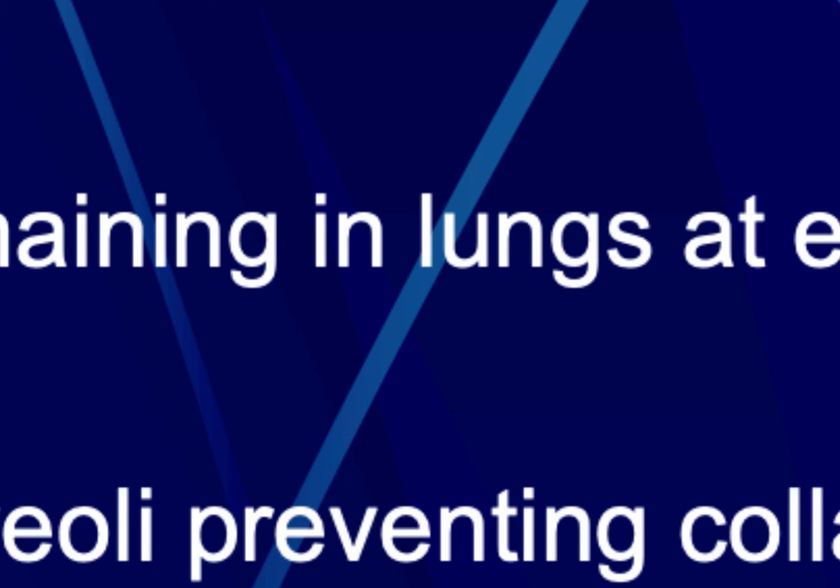All right. It does distend the alveoli, preventing collapse on expiration with that continued positive pressure, specifically when you guys are setting those PEEP levels to whatever you feel your patient needs, right? And it creates a greater surface area for gas exchange. Like I said, those alveoli are already stent open. They're already fully inflated, so that the next time we take that breath, the alveoli is already open. It stents open even more, stretching out those capillaries that are surrounding it in order for that oxygen molecule to move over into our system to be used for energy. And it really does decrease the work of breathing.